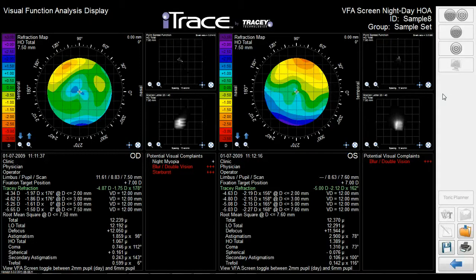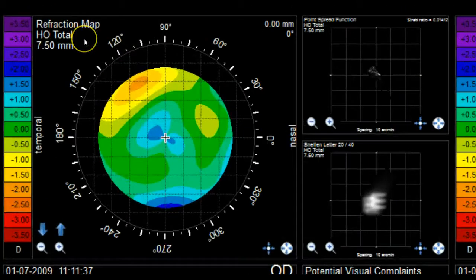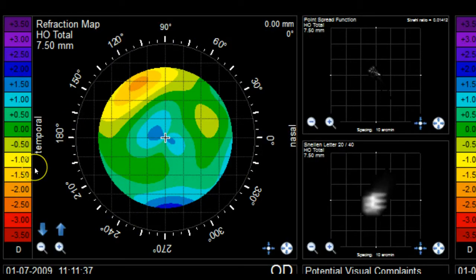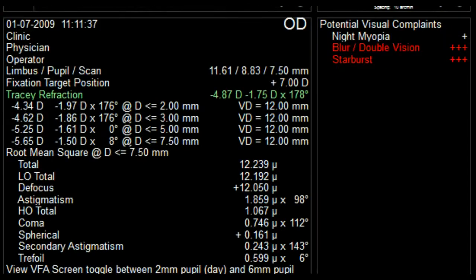Let's look at the elements available on this screen. First, we see the patient's refraction map, which is set to display higher order aberrations only. These are the aberrations that exist after the patient is corrected by traditional glasses or contact lenses. The color map shows in dioptric steps the refraction that results from the patient's higher order aberrations, and you can see areas where the patient's vision fluctuates by more than two diopters across the entrance pupil. The panel below the map shows details about this particular exam, such as physician and operator details, limbus size, pupil size, and the size of the iTrace scan.